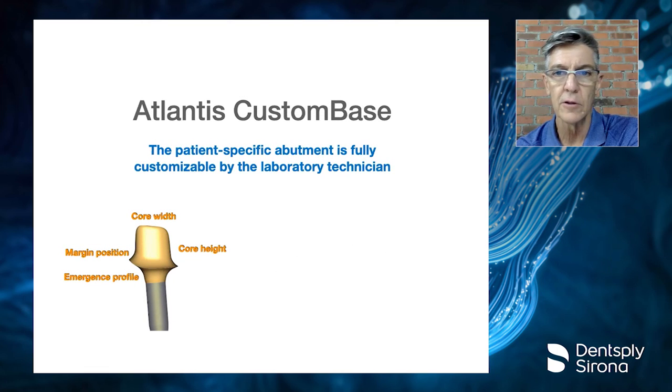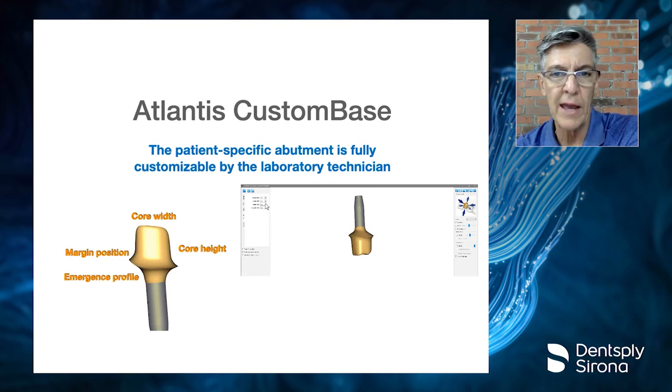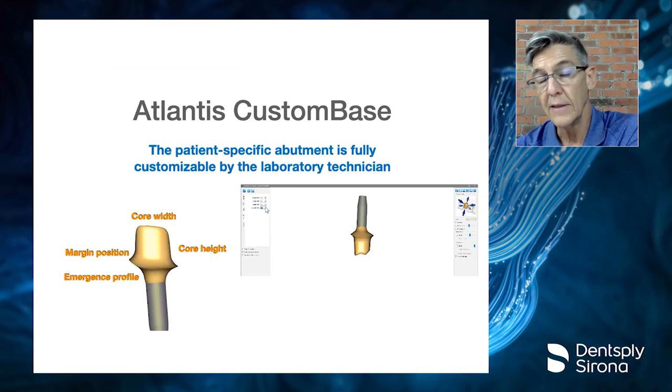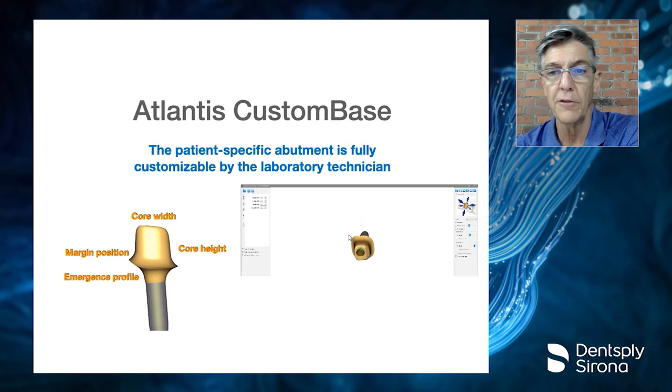Now, in this little short video, I'm showing how I modified the shape of an abutment. I was able to alter the margin width, the shoulder size, the height, the width of the abutment itself. And in this case, I wanted to have a little thicker ceramic for the restoration so it'd be stronger. So I created a broader shoulder.